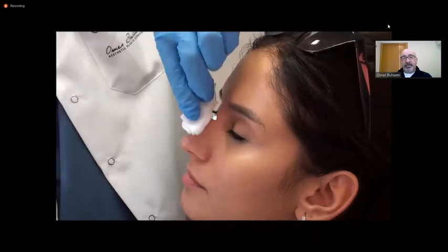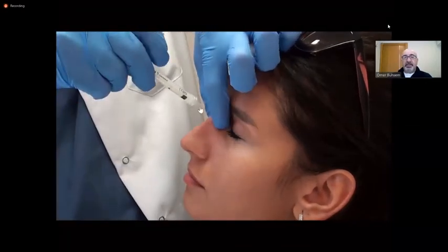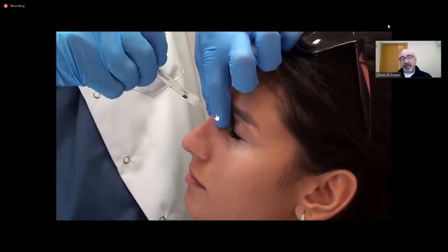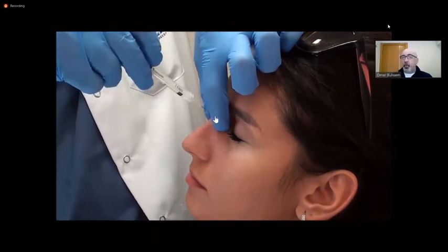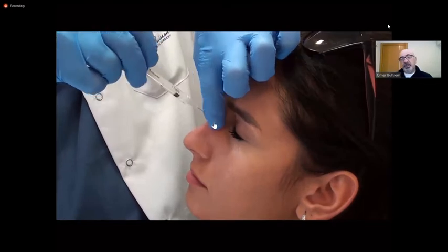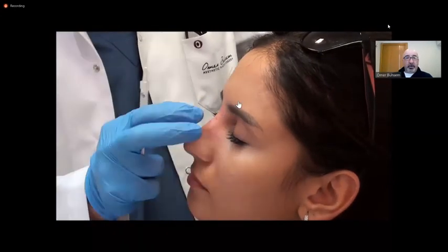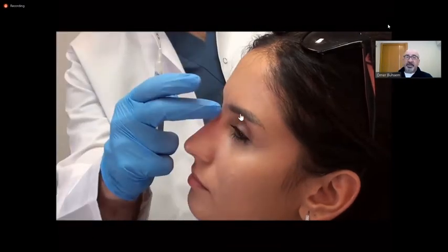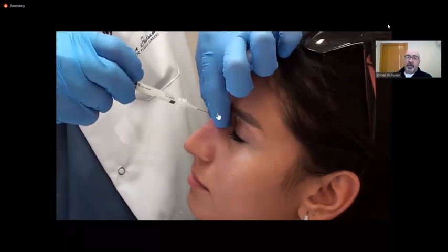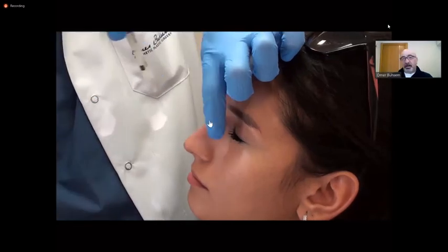Okay, and another injection technique, not with cannula, but for radix injections. If you want, you can use needle. We generally use 3.5 concentration and a 27 gauge needle, aspirate, and then give really small amounts, each time 0.1 ml. But you have to be sure that you are on the bone, just perpendicular injections, touch the bone, inject, aspirate, and inject very little amounts. Maybe you can inject 4 or 5 times, but each time just give 0.1 ml, and always push your non-dominant fingers laterally to prevent migration and any arterial complications. And that's all.